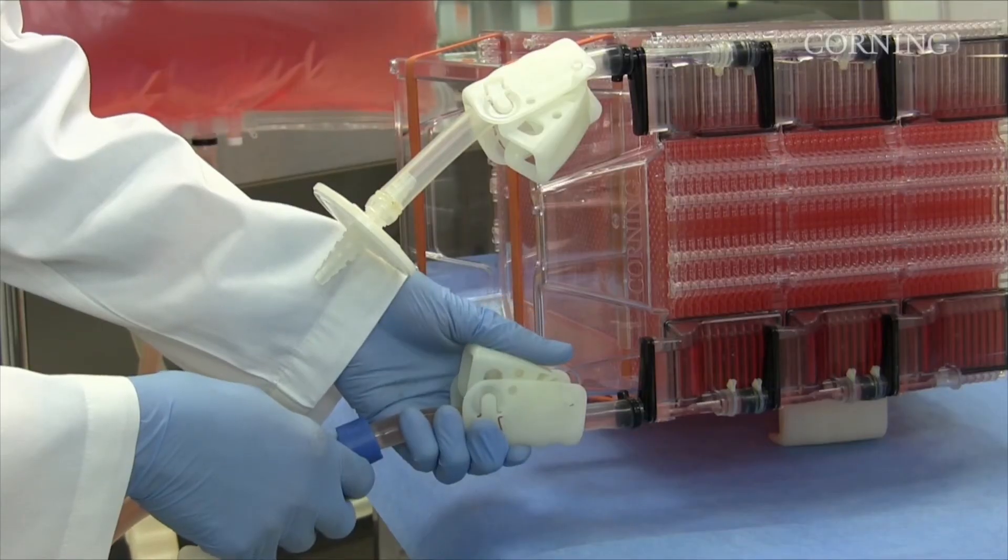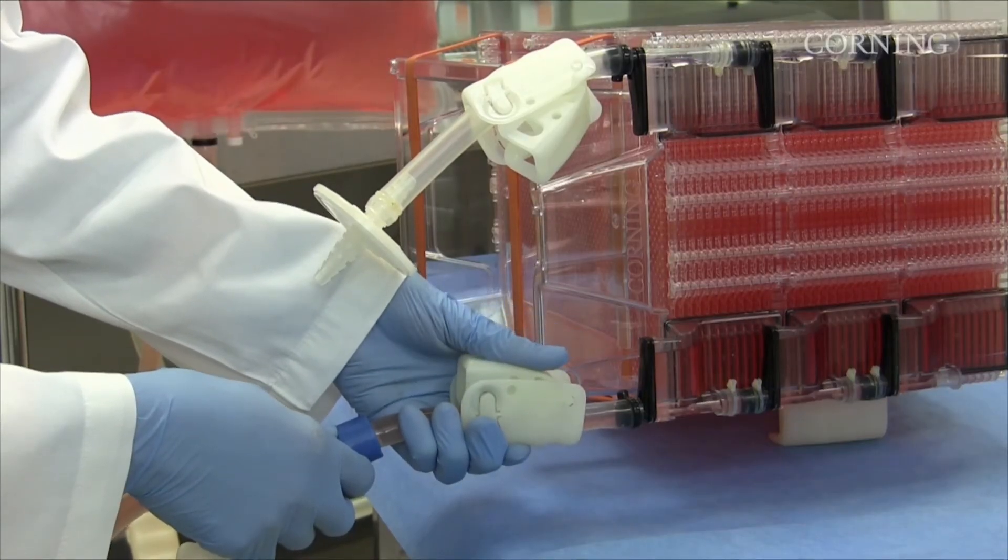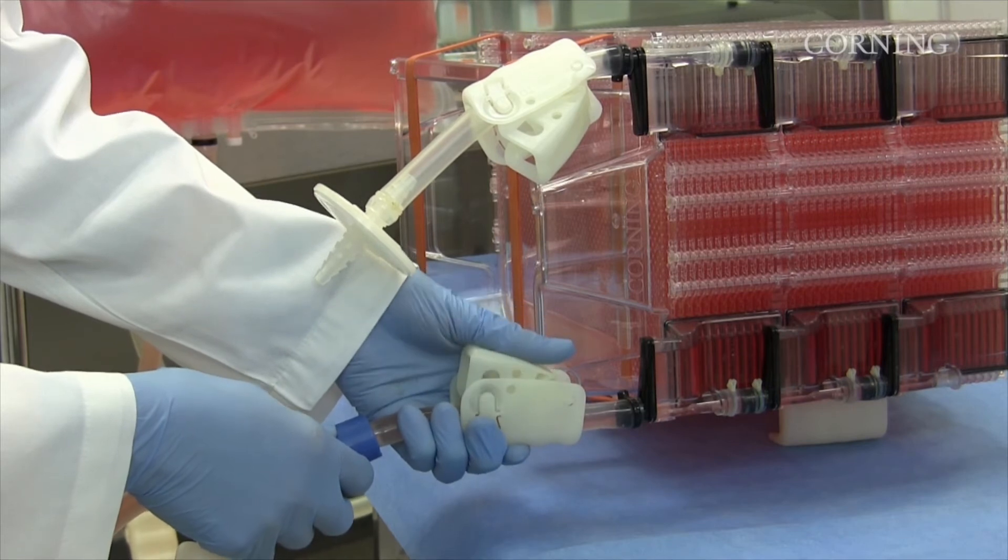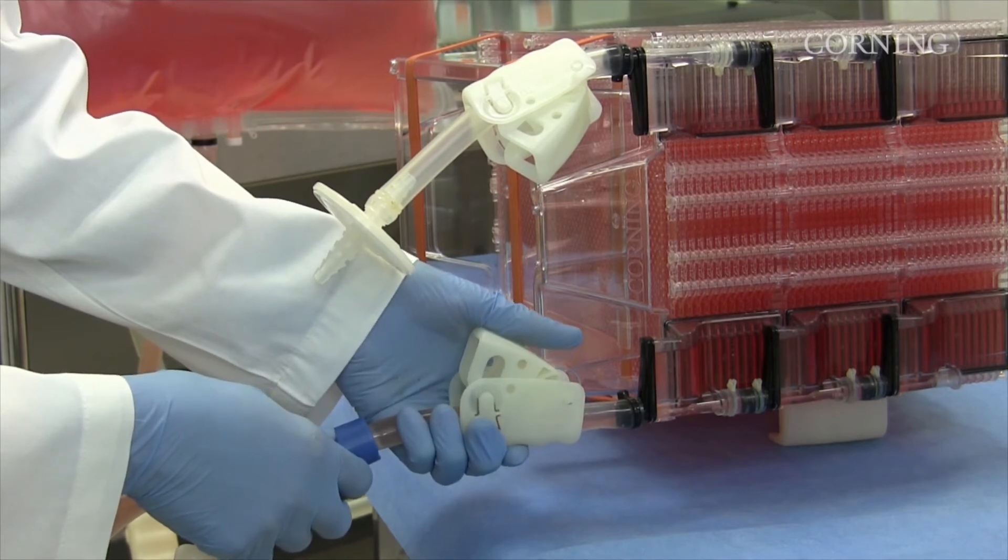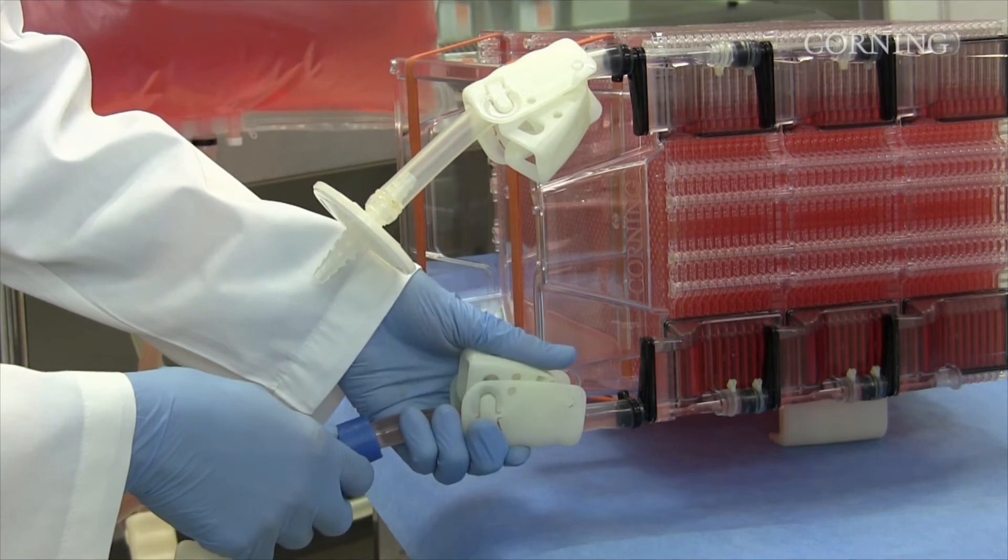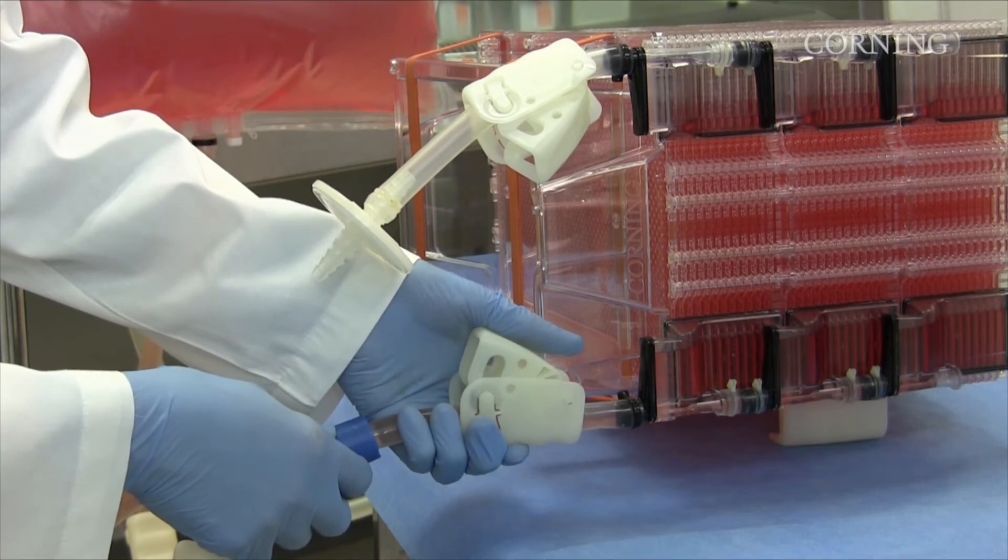When the vessel is three-quarters full, you can use the liquid handling tubing clamp as a handbrake to slow the flow of liquid into the HyperStack vessel and prevent overfilling. Never close the vent filter tubing clamp to control the flow rate.